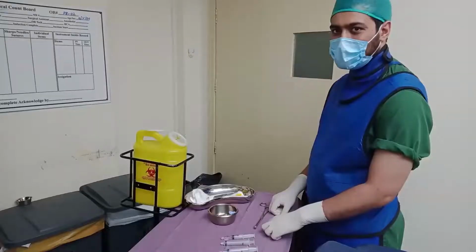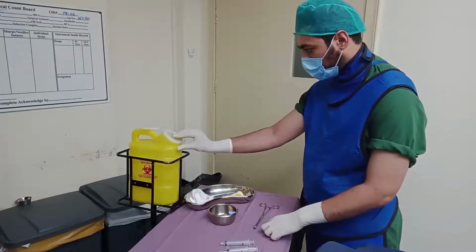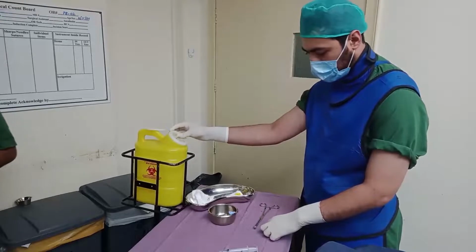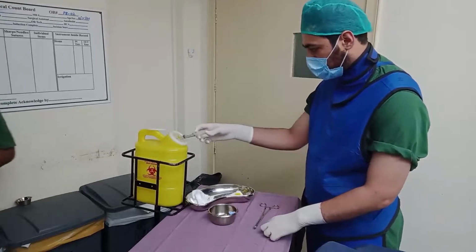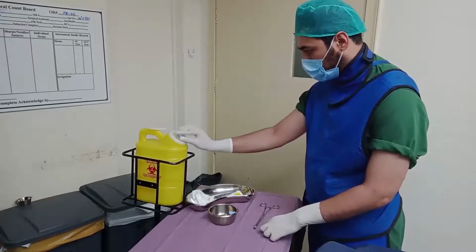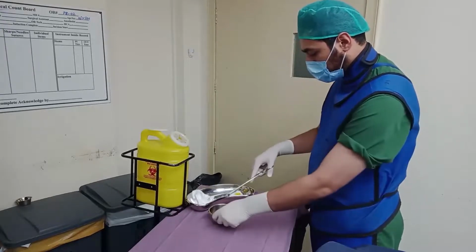At the end of the procedure, the sharps should be discarded by the person doing the procedure into the sharps bin. It is to ensure that it is discarded fully, and it makes it safer for the physicians and the staff working there.